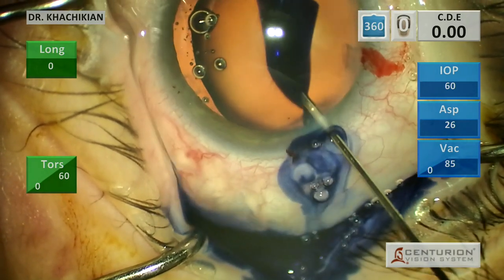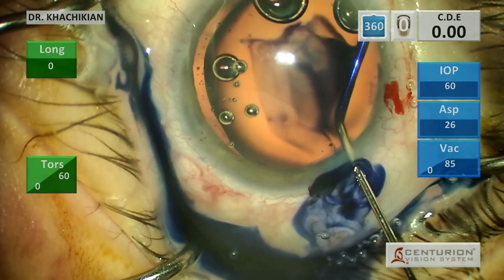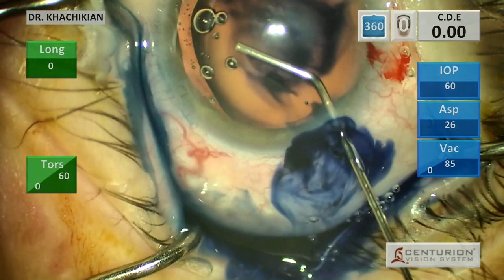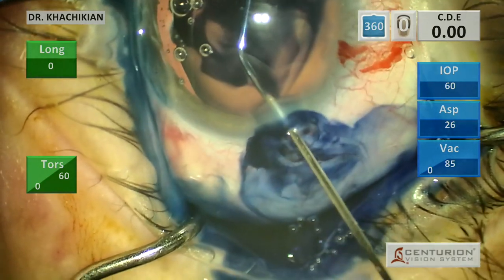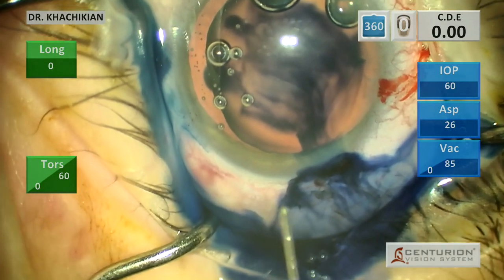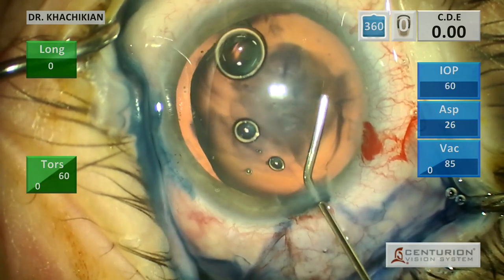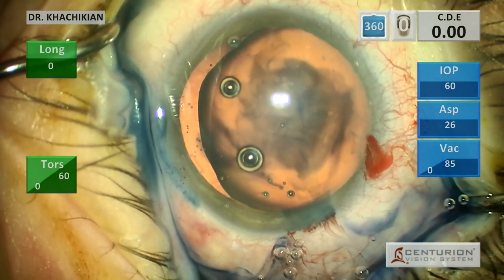Initially, what we're going to do is stain the anterior capsule and see how we do making our anterior capsular rexis, because I don't think there's any zonular loss. There's no vitreous that has come forward in that area. I just think these superior zonules, and possibly all of the zonules, are weak. We're going to stain with trypan blue and see what it's like making our capsular rexis, and see how much laxity there is as we do that.